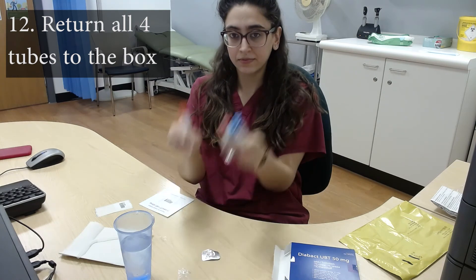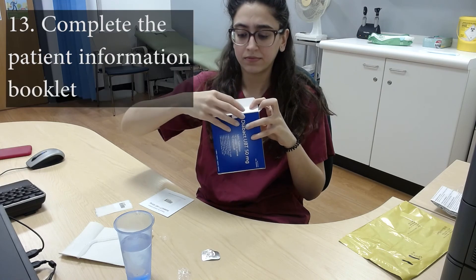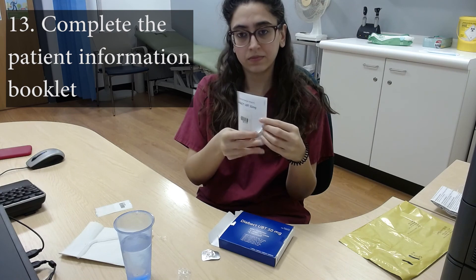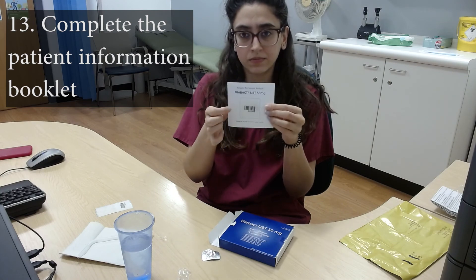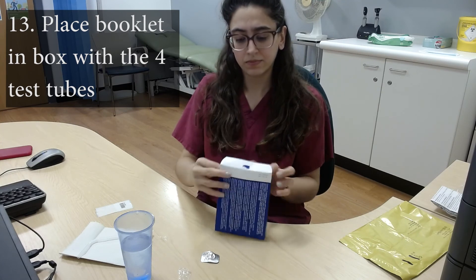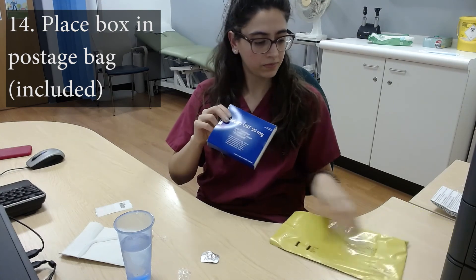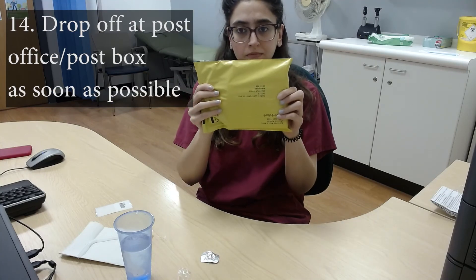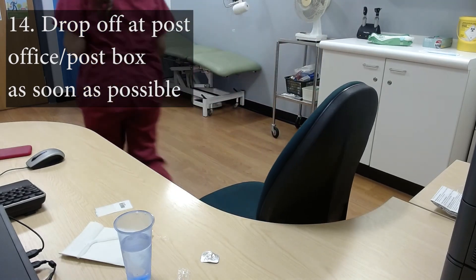Return all four tubes to the box. Please write your details on the inside of the form, including the date of the test as shown here. Ensure one barcode sticker is placed on the front as shown here. Place this inside the box with the tubes. Then place the box in the yellow postage bag provided and post it at your local post office or post box as soon as possible.